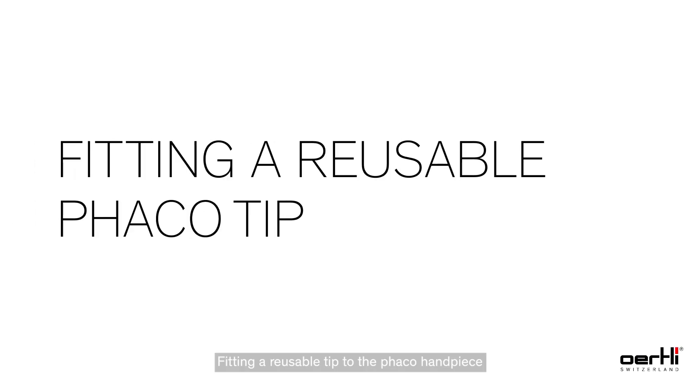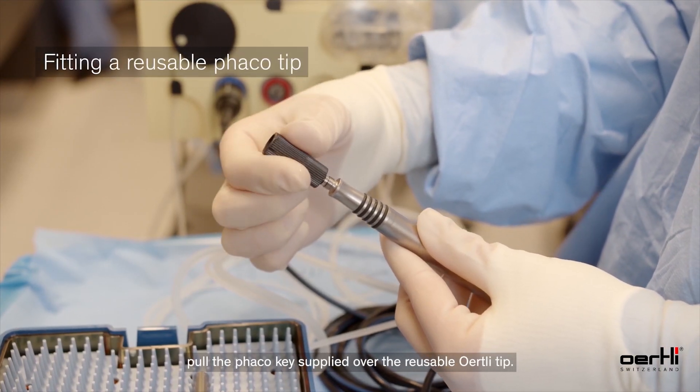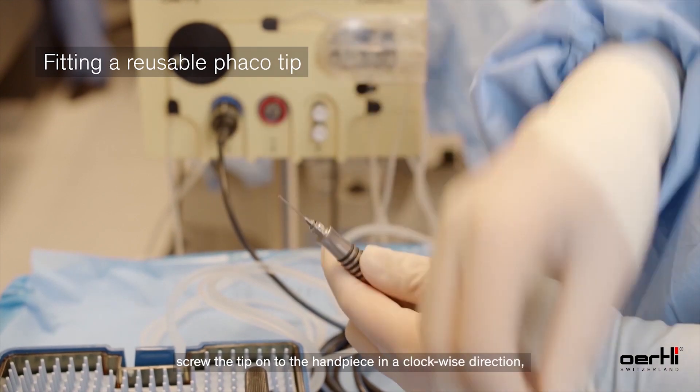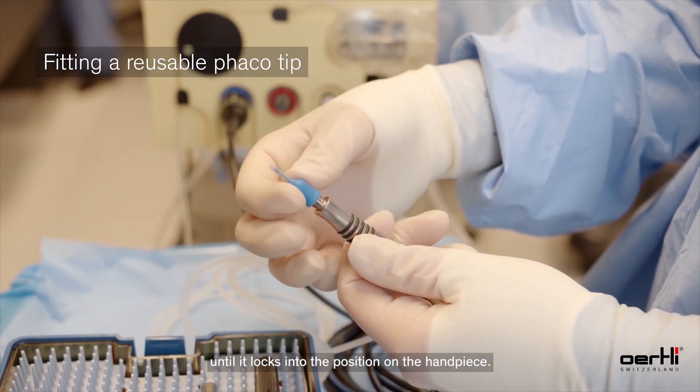Fitting a reusable tip to the FACO handpiece: to ensure proper fitting, pull the FACO key supplied over the reusable tip, applying slight axial pressure. Screw the tip onto the FACO handpiece in a clockwise direction until it locks into position on the handpiece.